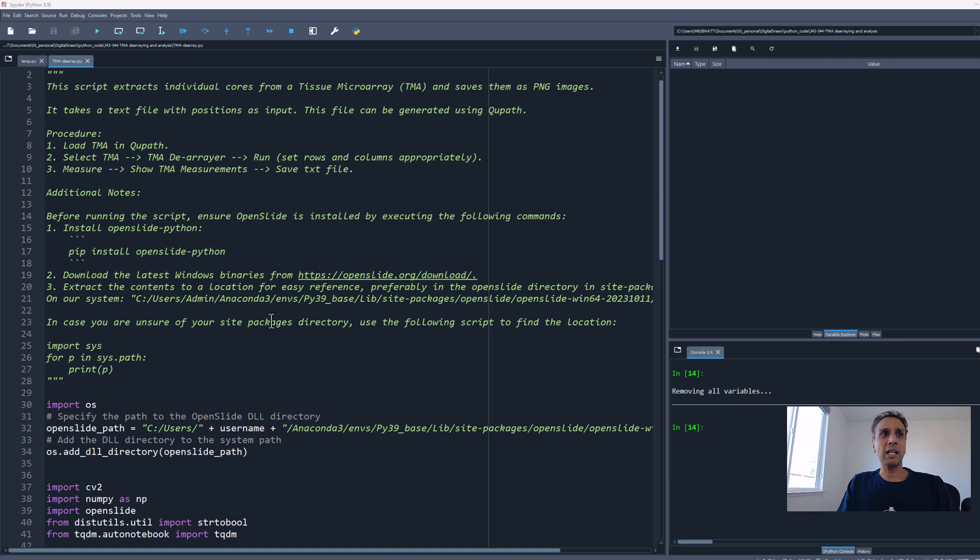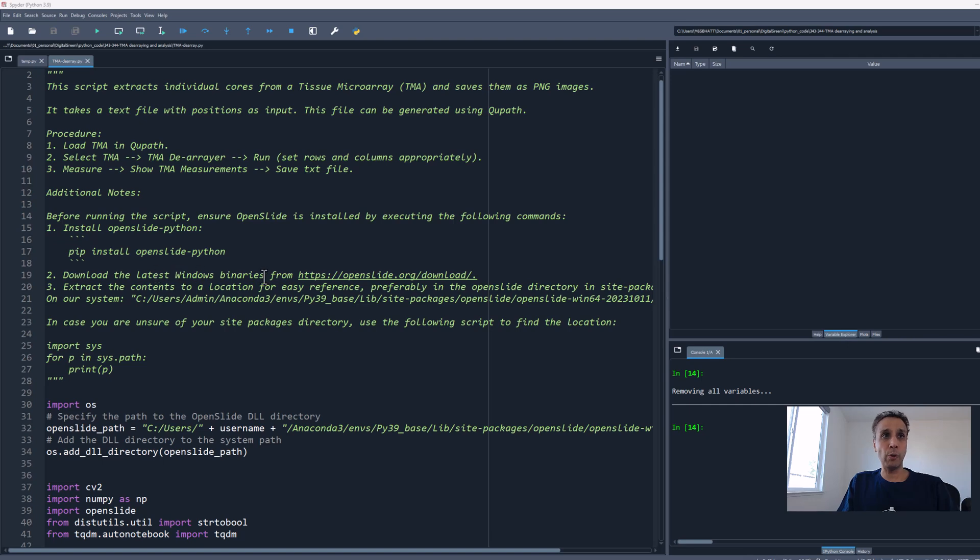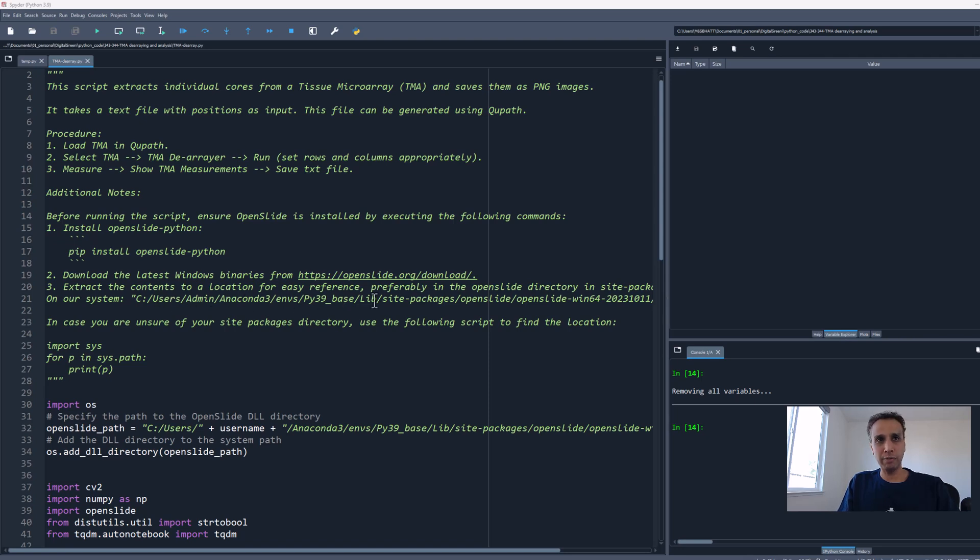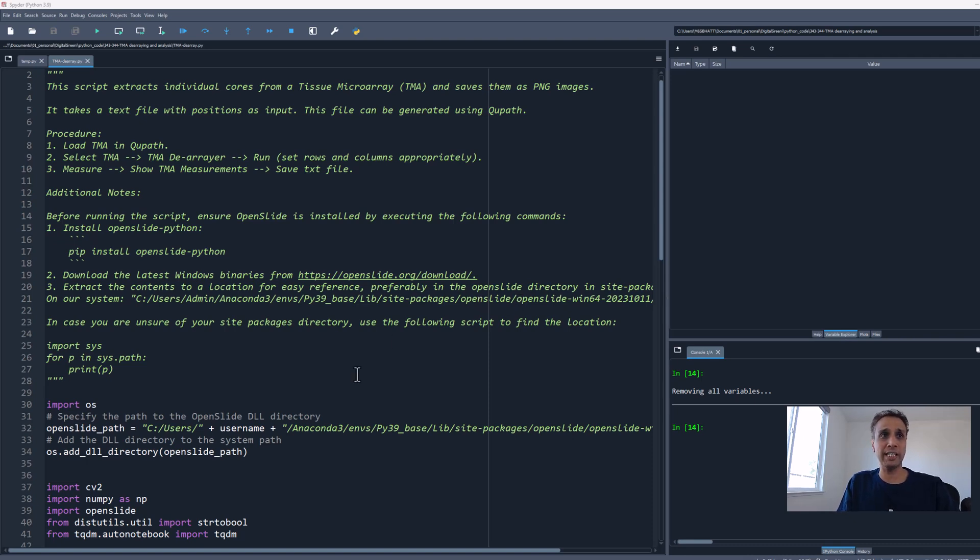Unlike other libraries, you're not done when you just pip install. You need to download the Windows binaries if you're on Windows. Look for the binaries, download them, and point at that location.